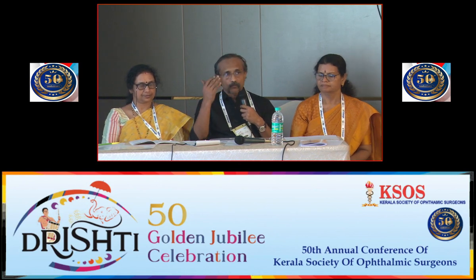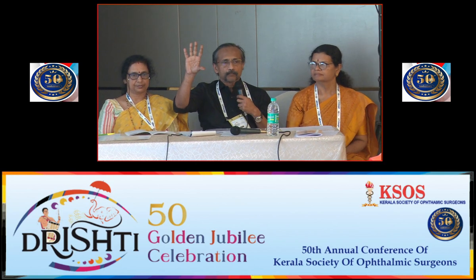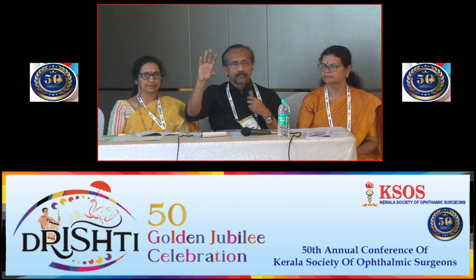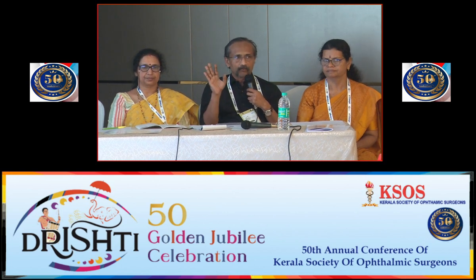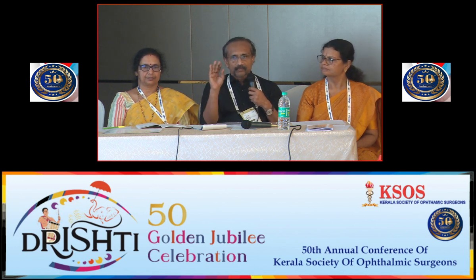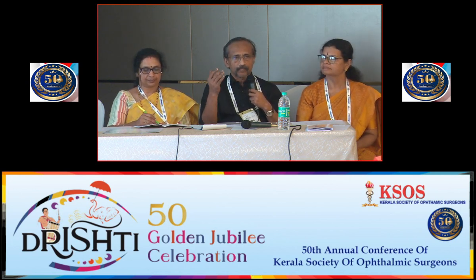That is one thing. And then you check for the visual acuity. Visual acuity, you check for distance. You ask the patient to blink, and see whether the vision continues to remain stable during the blink and after the blink. If it is not stable after the blink, it is loose. That is one idea that you will get, and immediately you will try to change the base curve. Second thing is, whenever you do over refract, fog the other eye so that the patient doesn't accommodate.